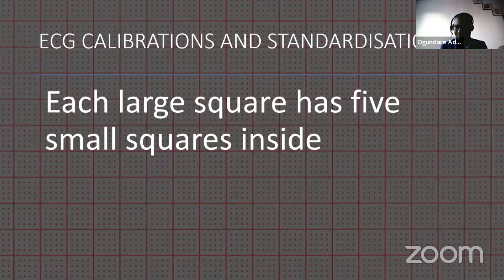So that is it. A small box is going to take 0.04 seconds. So if a large box is 5 millimeters wide, and that takes us 0.2 seconds, and I've mentioned that a large box has 5 smaller boxes, so one small box is 1 millimeter. So how many seconds is it going to take a small box? Just divide it by 5.